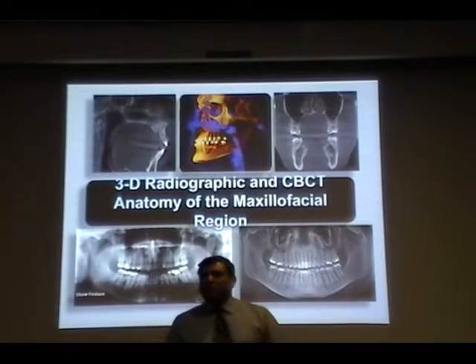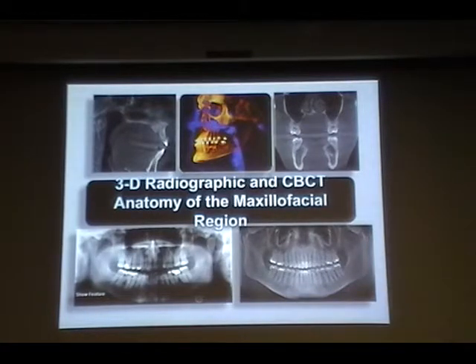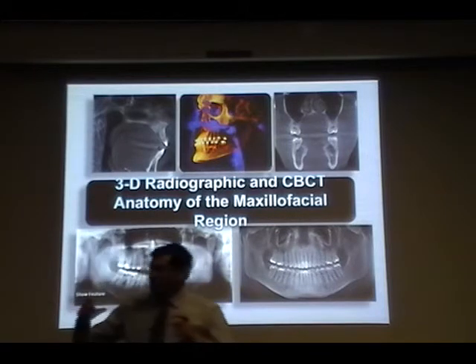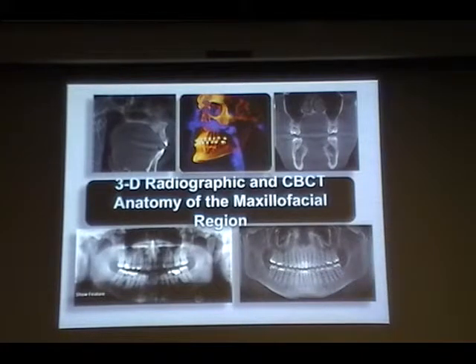This may be a little dry, like radiology or physics, because what I'm going to talk about, the ramus, the head of the condyle, is the head of the condyle. It's not going to change. But what I have done in this lecture is three things. There is a dry skull image that you can compare, then a panoramic radiograph image, and then a CBCT image, so you can look at those three and identify the structures.